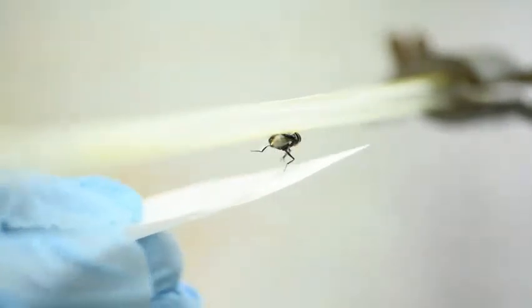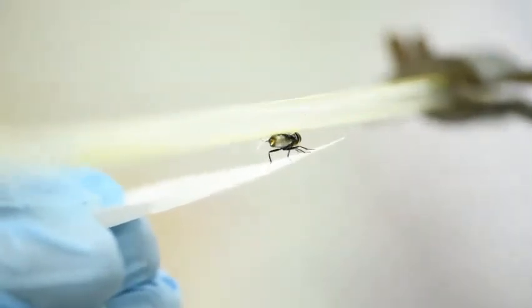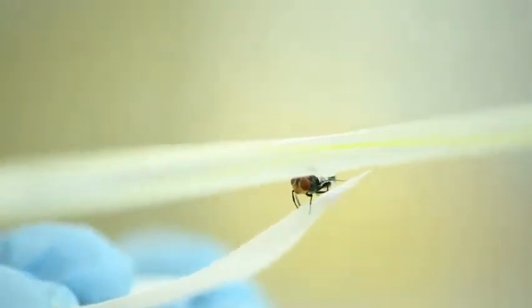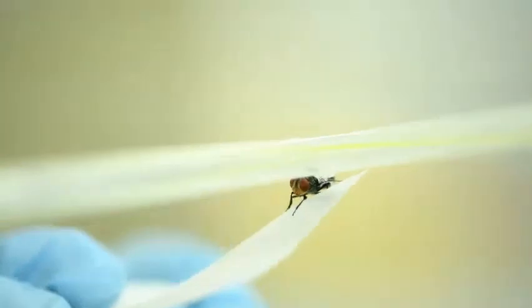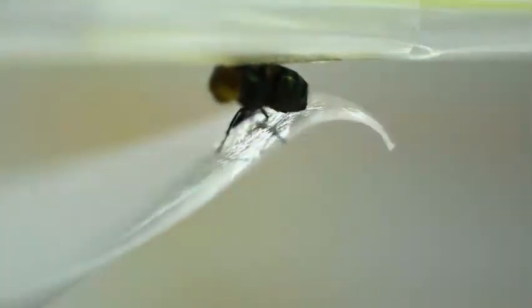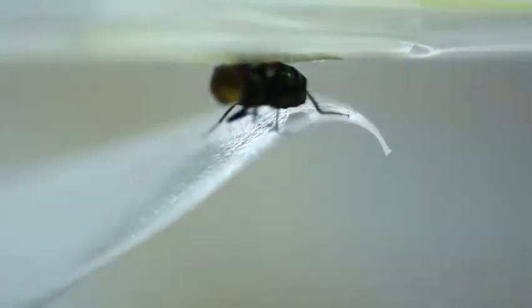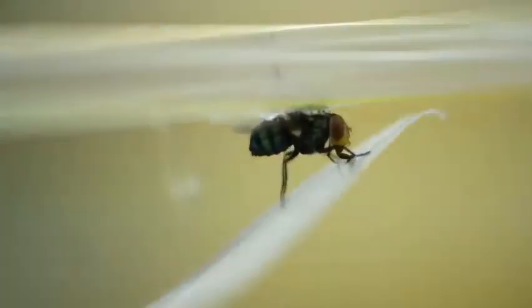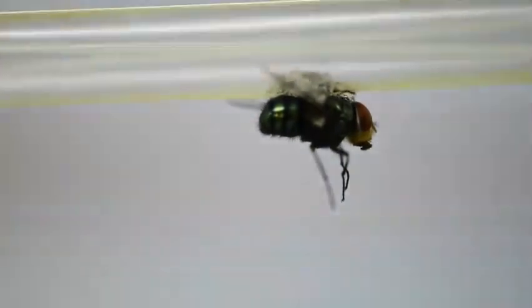Individual 1, individual 2, done, 3. It is a bit wet. Done. Individual 4. Alhamdulillah. Individual 5.